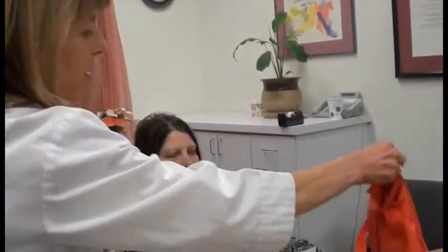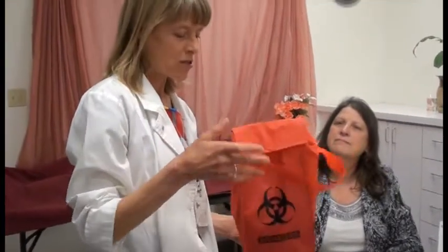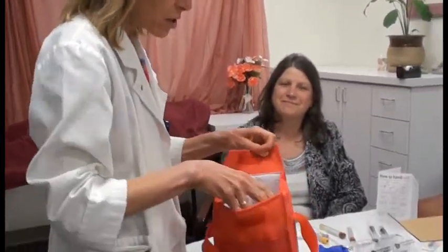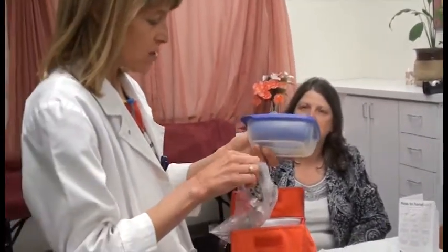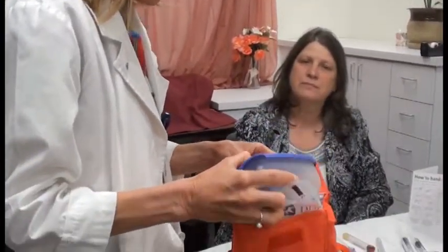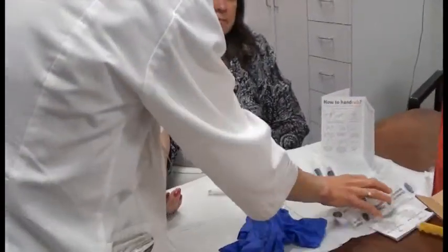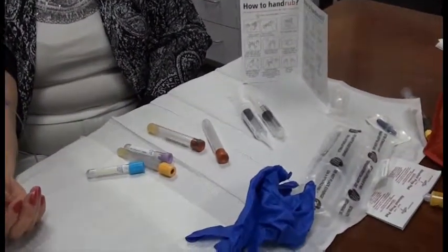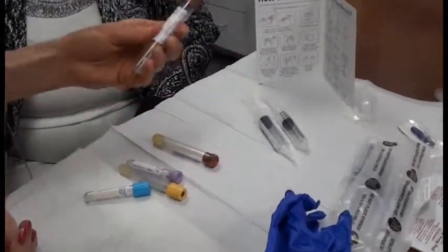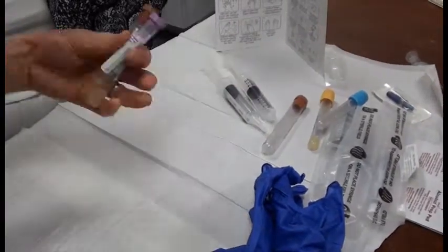Your other piece of gear would be your biohazard lunchbox, your biohazard bag, so that your labs can be toted correctly within your plastic container, so that in case there's an accident, your stuff and their blood doesn't get all mixed up together. So that's part of the gear to bring in. The other part of the gear is obviously the lab tubes that you will need and the flushes that are sufficient for what you need to draw. In this case, we will draw a tiger top and a PT/INR.